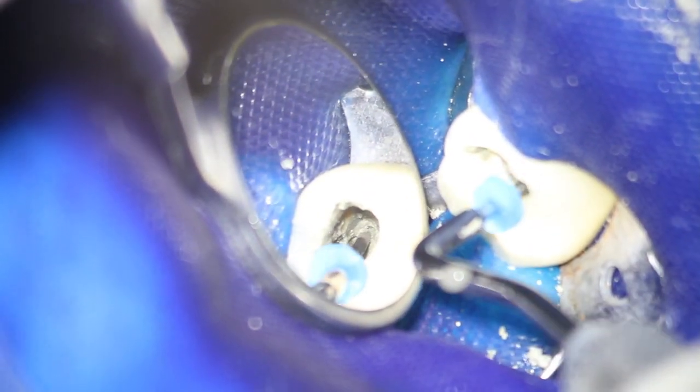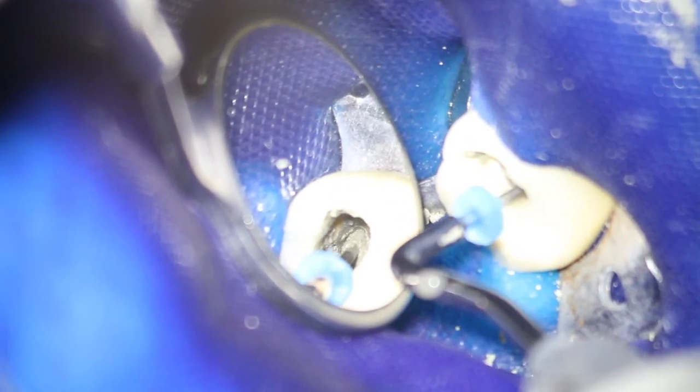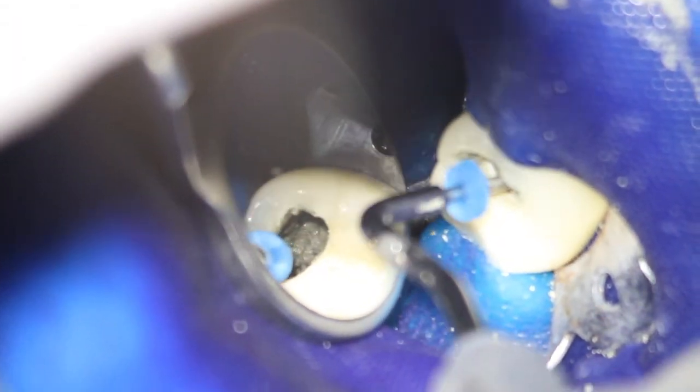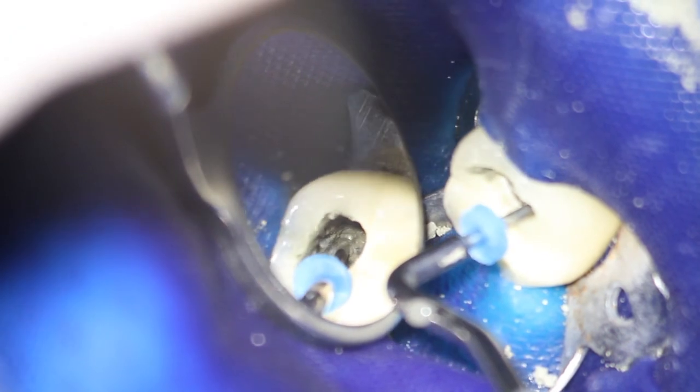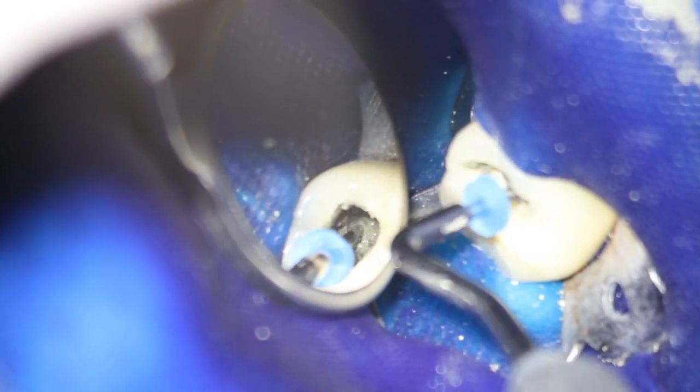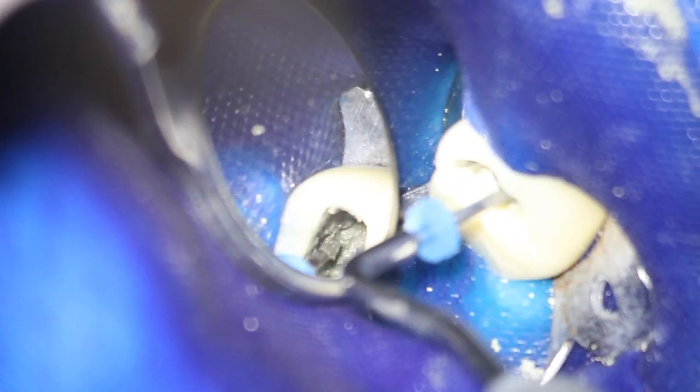The major disadvantage of this technique is that you have less control over it, especially when you have a wide open apex. So it is possible that you push MTA over the neo apex. Is it a real problem? I don't think so, but it can be avoided. It is better, I think.